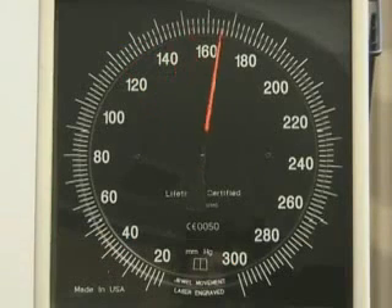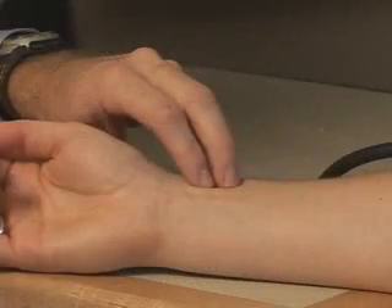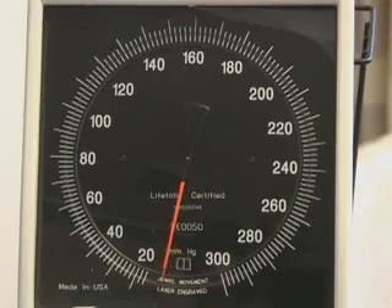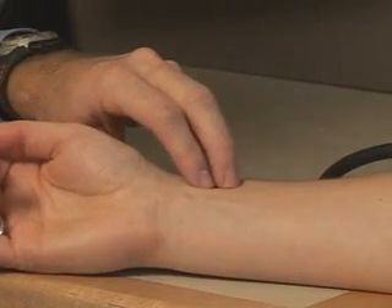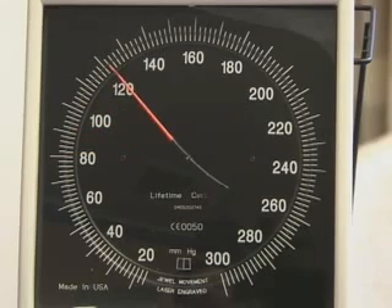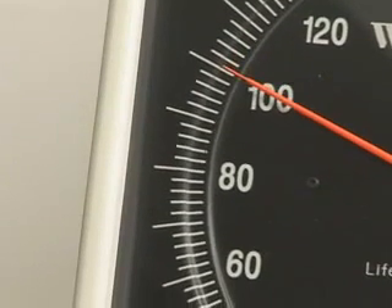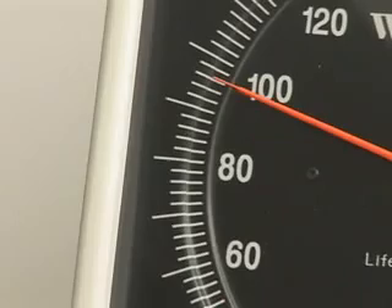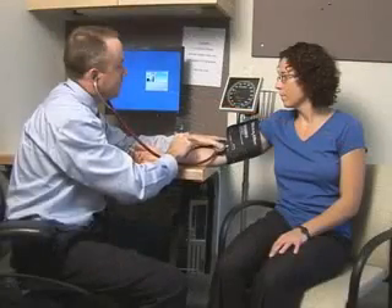Inflating the cuff to some arbitrary level runs the risk of excessive overinflation. To avoid this, determine the measurement of the pulse obliteration pressure. Rapidly inflate the cuff to 80 mmHg while palpating the radial artery pulse, then continue to inflate in 10 mmHg increments, taking note of the reading at which the pulse disappears. Then deflate the cuff at a rate of 2 mmHg per second, noting when the pulse reappears. Once the pulse obliteration pressure is determined, you are ready to measure the blood pressure.